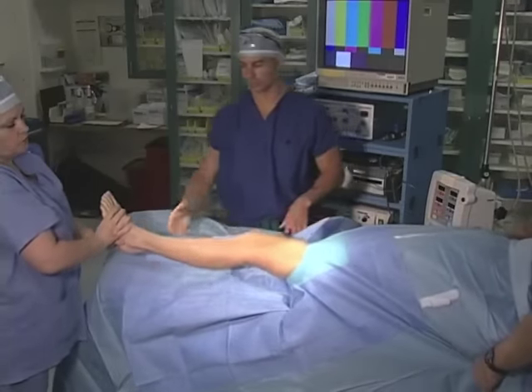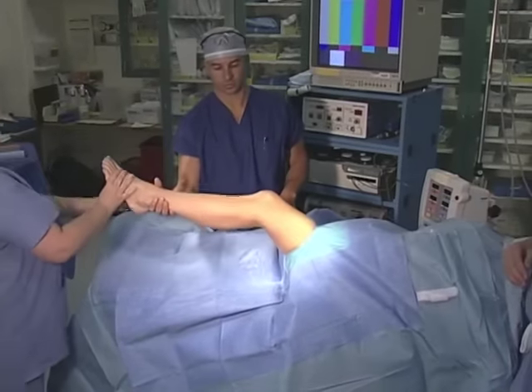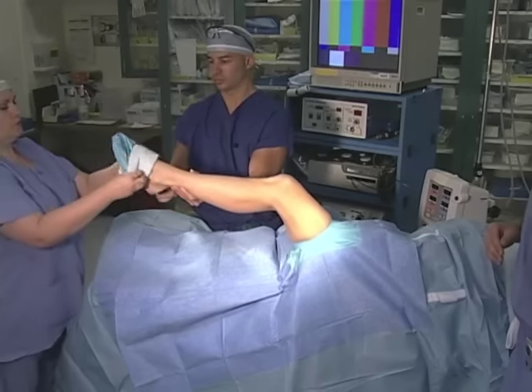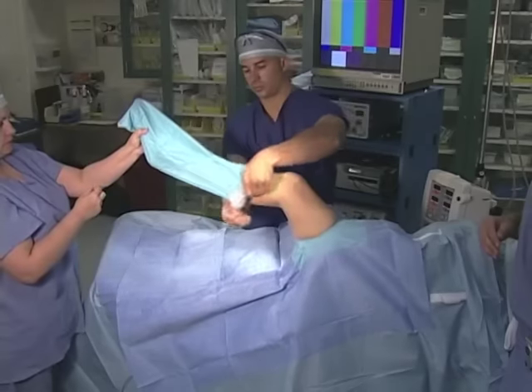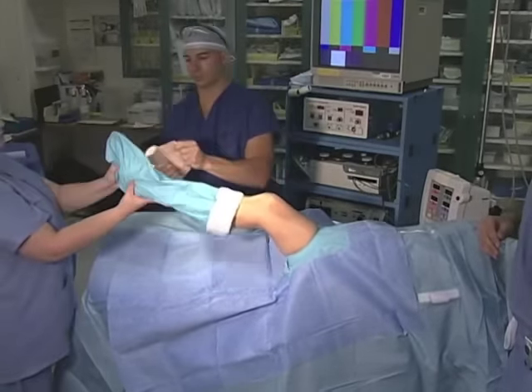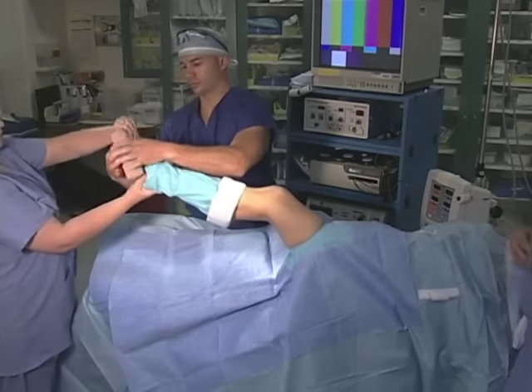As an option, an impermeable stockinette may be placed over the foot to seal it off from the arthroscopic field. The stockinette may be held in position with co-band tape, which sticks to itself and holds it in place.